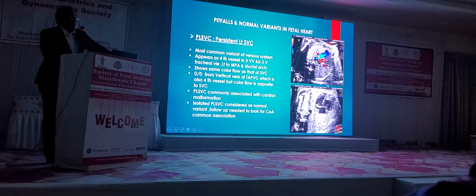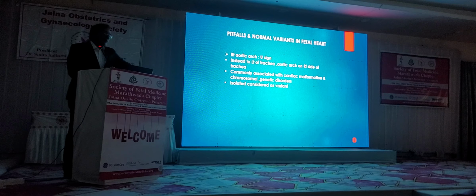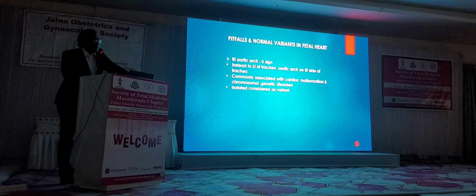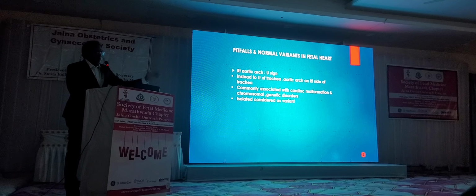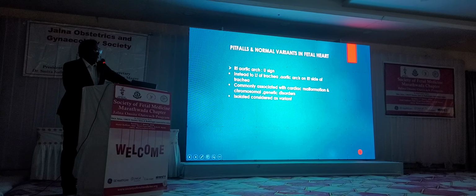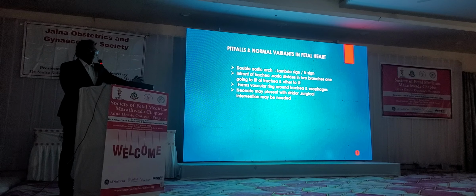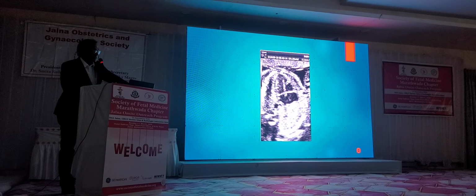Plus, these cases are associated with coarctation of aorta. If you want to be safe, just advise fetal echo in the third trimester or postnatal echo of the neonate, because coarctation of aorta is an evolving anomaly and has a strong association with this. One more variant is right aortic arch, we have already seen. Double aortic arch, we have already seen. This is not a very normal thing actually. It can be abnormal because the fetus may present with breathlessness.